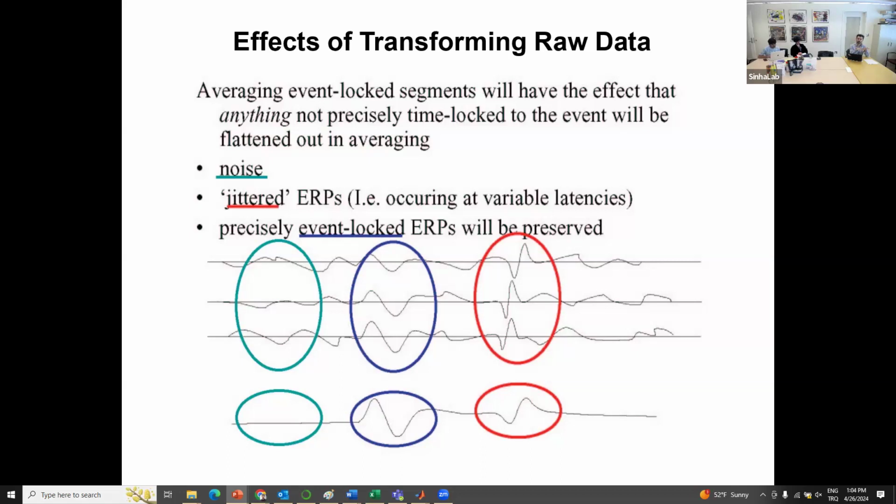So when you collect your EEG signal, you have to make sure that the subject doesn't think about anything else, or is not under the influence of caffeine or other such stimulants. The idea behind all these requirements is to make sure that when you run an ERP, you have a time locked and phase locked signal.